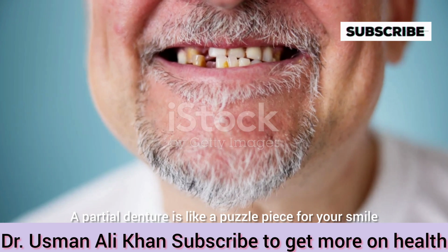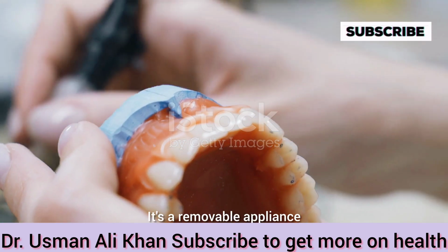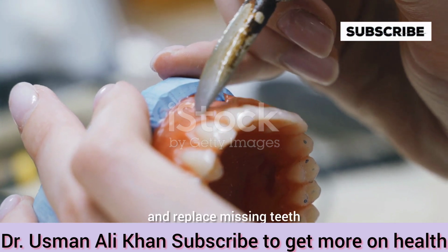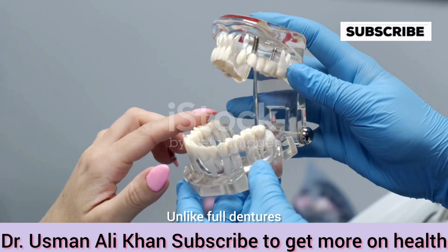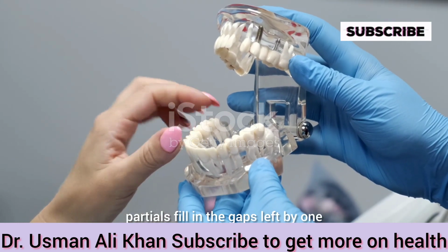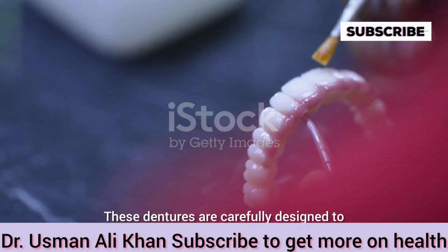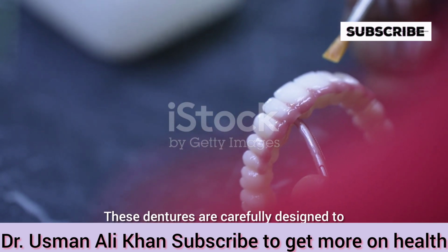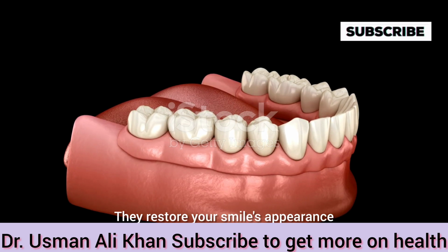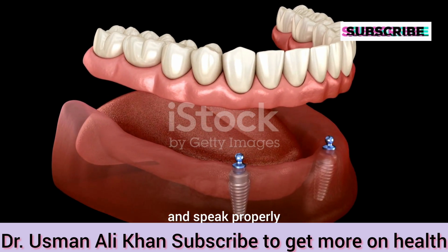A partial denture is like a puzzle piece for your smile. It's a removable appliance, custom-made to fit your mouth and replace missing teeth. Unlike full dentures, which replace all teeth on an arch, partials fill in the gaps left by one or a few missing teeth. These dentures are carefully designed to blend seamlessly with your natural teeth. They restore your smile's appearance and improve your ability to chew and speak properly.